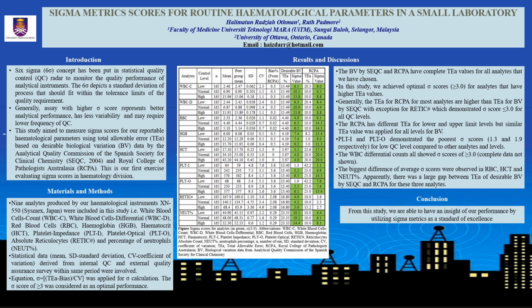As a conclusion, we are able to have an overview of our quality performance by utilizing the sigma metric score. Further analysis is needed to utilize this finding to help us in setting up specific QC rules for our hematological parameters. With that, thank you very much.